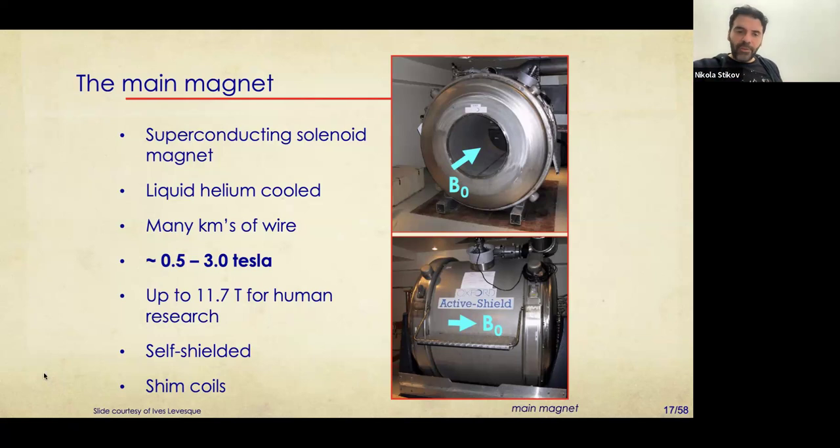There's also a couple of other fields that we're not going to talk too much about, but there's shimming coils. Those are the coils that ensure that this magnet has exactly 3 Tesla or exactly 1.5 Tesla. It's very important that the magnet is very uniform, because if it is not, you will have different kinds of image distortions, and then it's no good. Your millions have gone to waste.